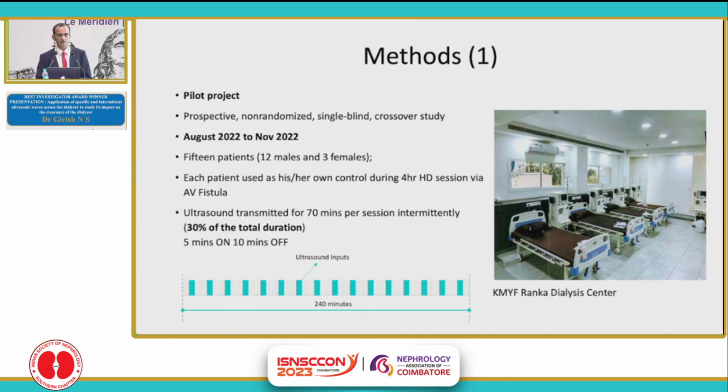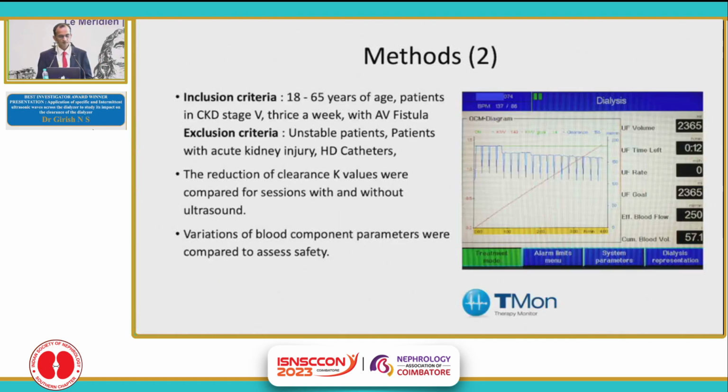The way we applied these ultrasonic waves was to cover a total of 30% of the time duration, roughly 70 minutes, in an intermittent way, 5 minutes on and then 10 minutes off. The inclusion criteria was that the patient had to be stable, on dialysis 3 times a week with a fistula, aged 18 to 65 years. Any unstable patients, those with acute kidney injury, or dialysis catheters, we excluded.